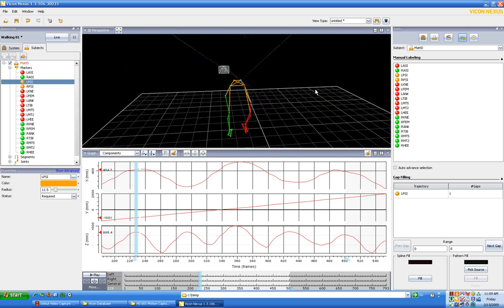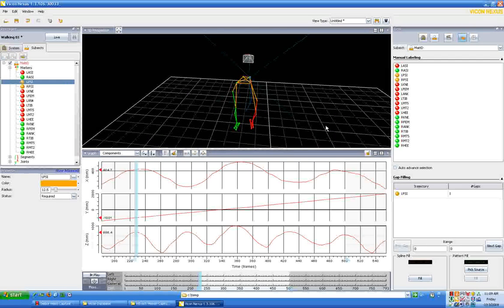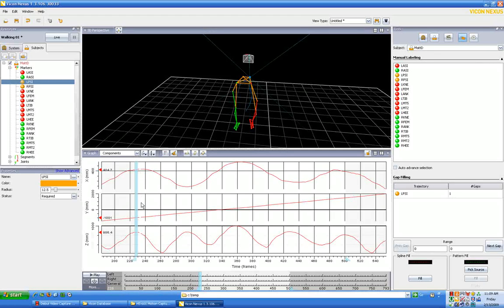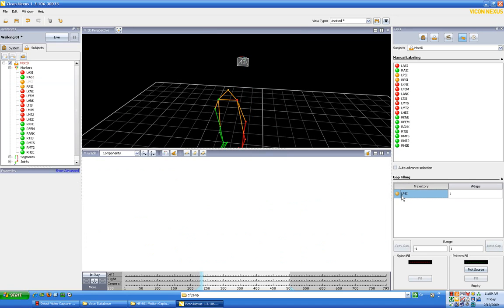This looks like a fairly easy sequence. It's a one frame gap and we can see where there's a gap - LPSI, it's a one frame gap. So what we can do is we can go ahead and click on that and it's going to ask us how do we want to fill this gap.